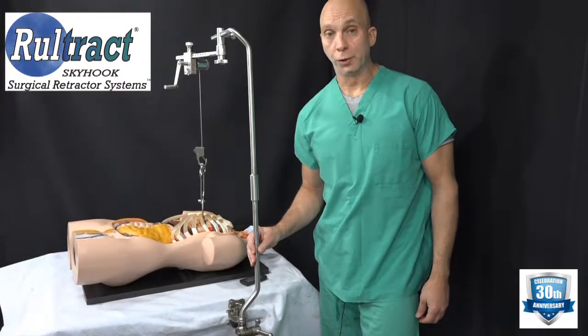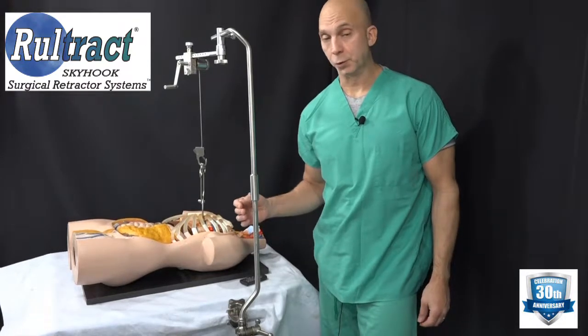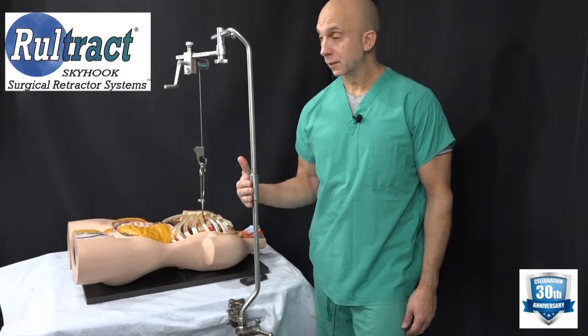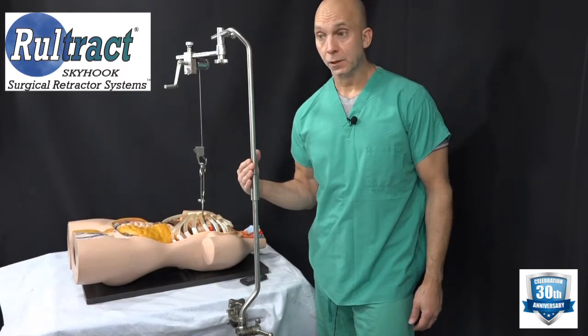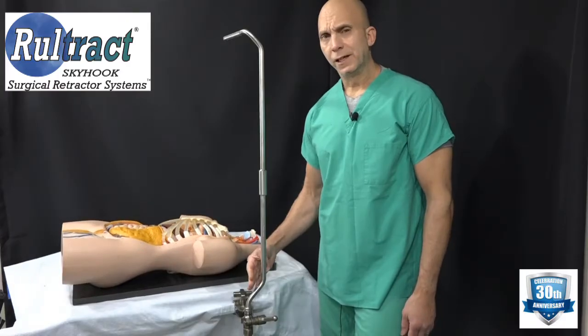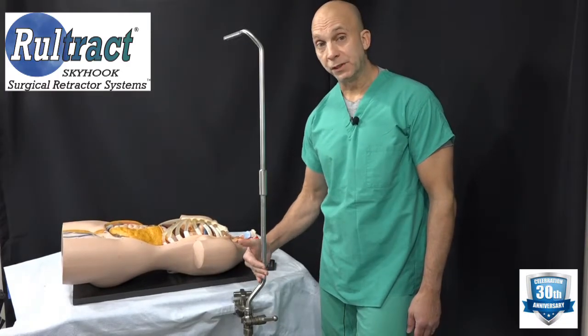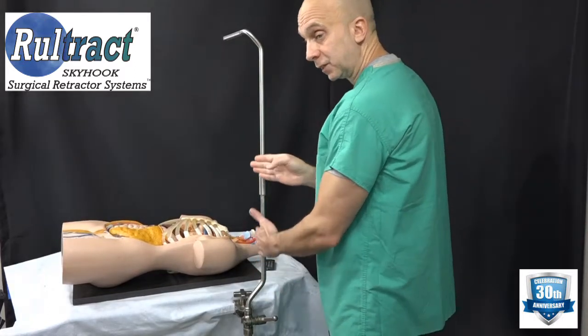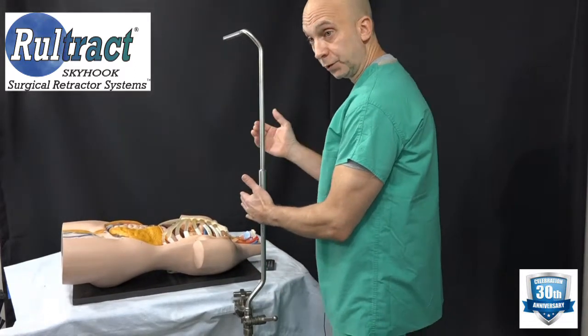Hello, my name is Philip Rouleau with Rultract, and I am going to explain how to set up our thoracic post system specifically for the Nuss procedure. As you can see, there are specific bends in the post that are designed to allow for more space for the assistant or the surgeon.